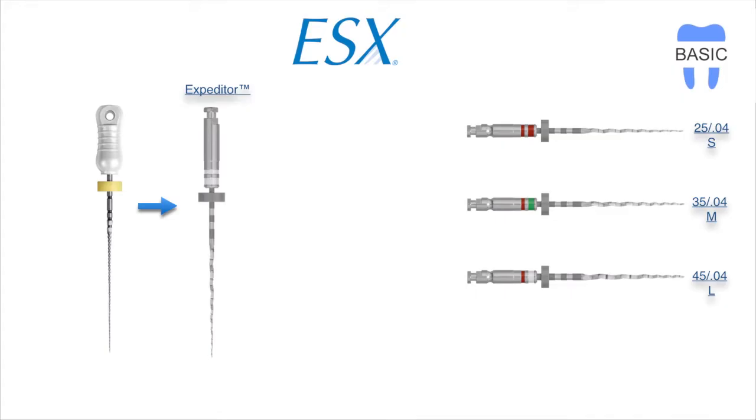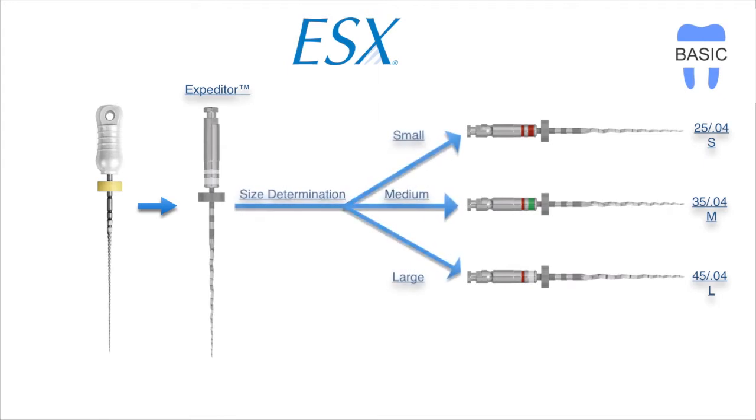It's time to take a look at a case, but just before I do so, I wanted to once again very quickly go over the basic technique and differentiate the difference between the basic and the advanced technique when it comes to the ESX file. As we can see here in this slide, this is the basic ESX protocol.